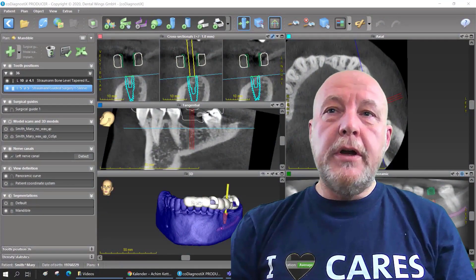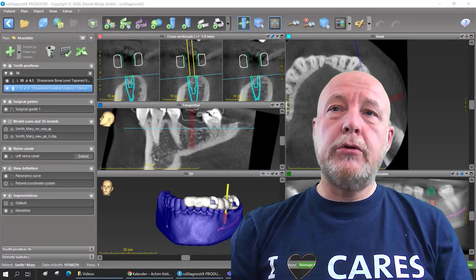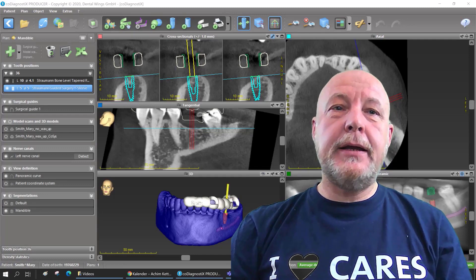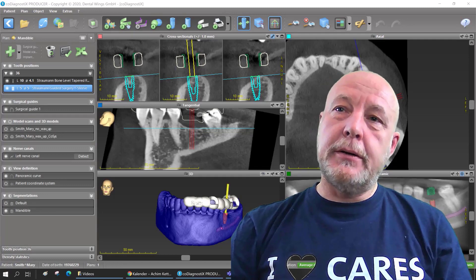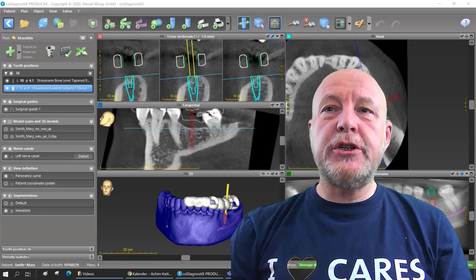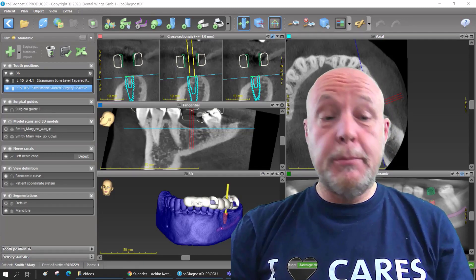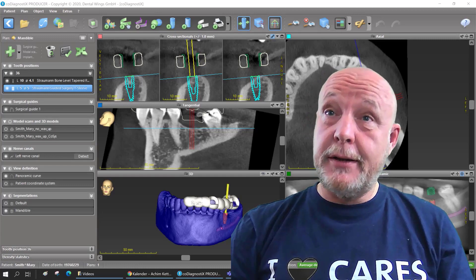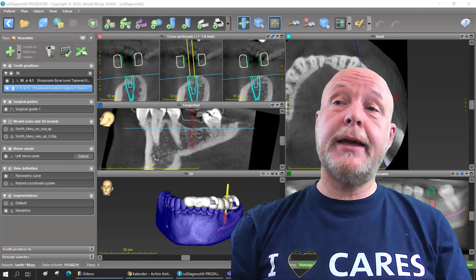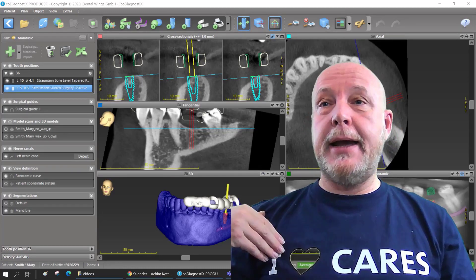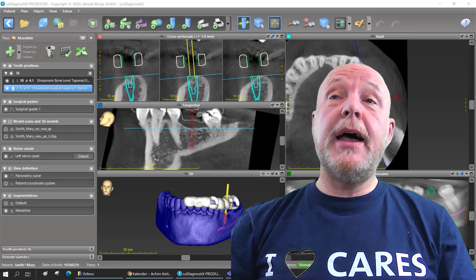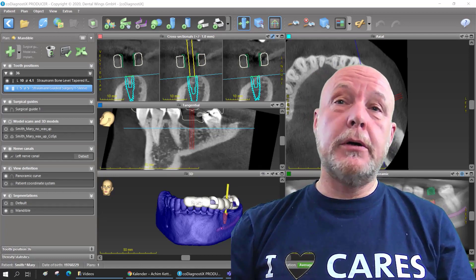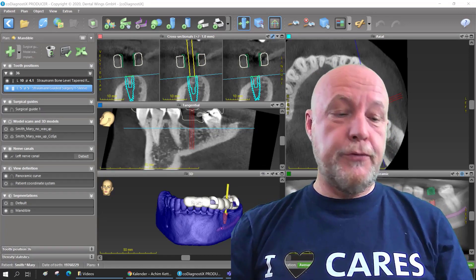If you are working with co-diagnostics for a longer time, I can give you a recommendation to make it a little bit more comfortable. And if you are a dental technician working with CAD-CAM like CARES, then it is even more important for you.